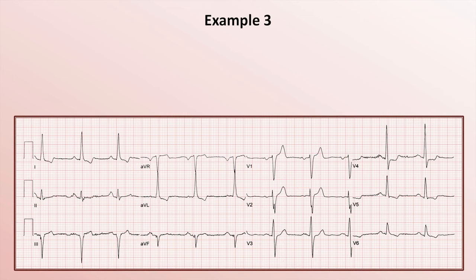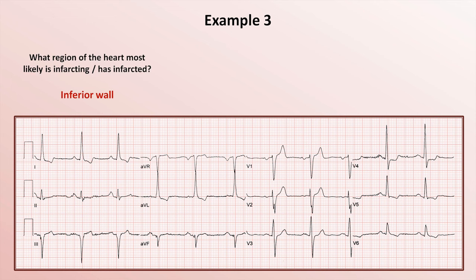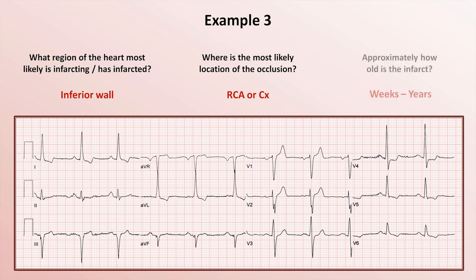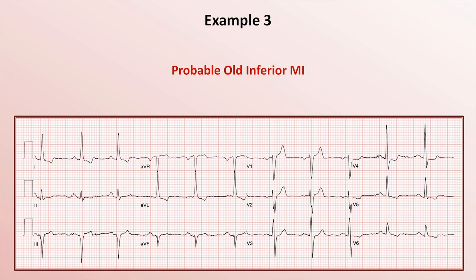In example 3, there are no ST elevations, but Q-waves are seen in 2, 3, and AVF, suggesting the infarct affected the inferior wall. Q-waves don't localize quite as well as ST elevations, so this is just a reasonable hypothesis. As with example 1, we can't say whether the inferior wall is supplied by the RCA or circumflex. With Q-waves present and no other ischemic changes, the infarct must be old — defined as anything from weeks to years. Summary: a probable old inferior infarct. The ST depressions and T-wave inversions in 1 and AVL are not reciprocal changes; they are likely a secondary repolarization abnormality due to left ventricular hypertrophy.